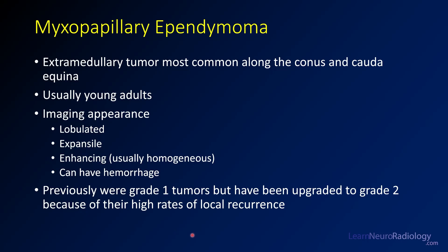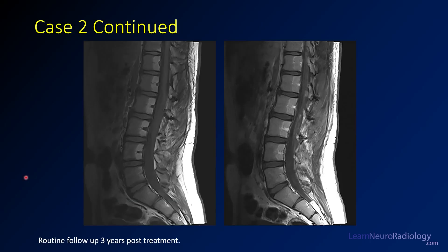These were previously called grade one tumors, but in the most recent WHO classification they've been upgraded to grade two because of high rates of local recurrence. On routine follow-up about three years later, the pre-contrast and post-contrast T1 images show fat deposition in areas covered by radiation — confirming prior radiation therapy. On post-contrast, you see nodular enhancement along the nerve roots of the cauda equina: areas of tumor recurrence. Even though myxopapillary ependymomas are relatively indolent, they're really prone to local recurrence.